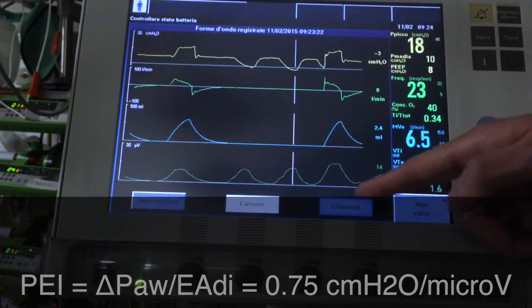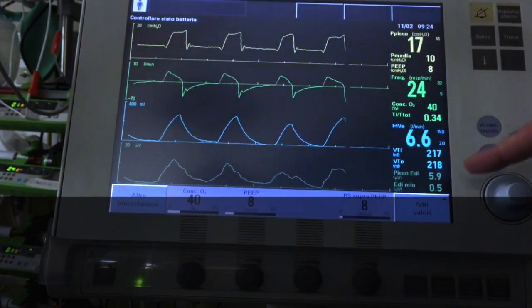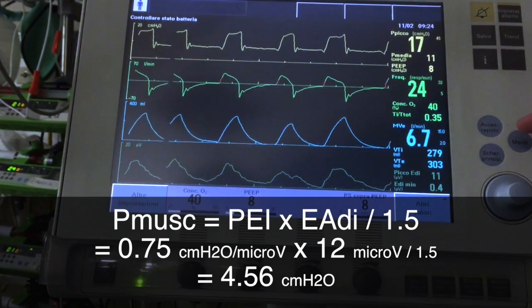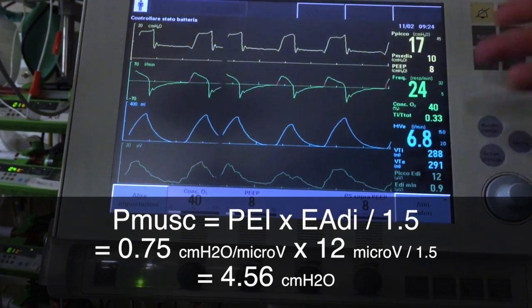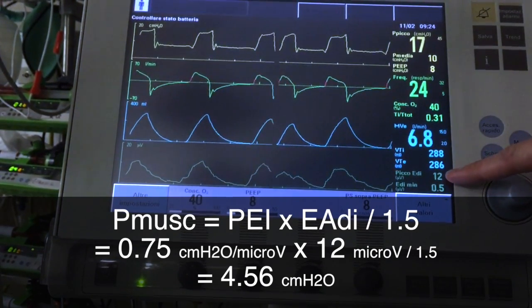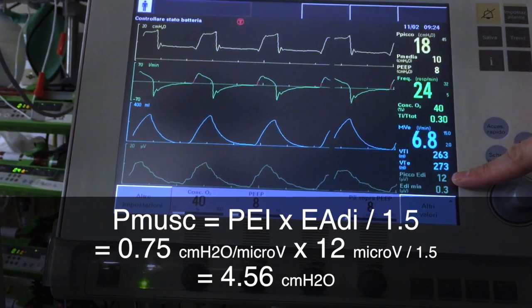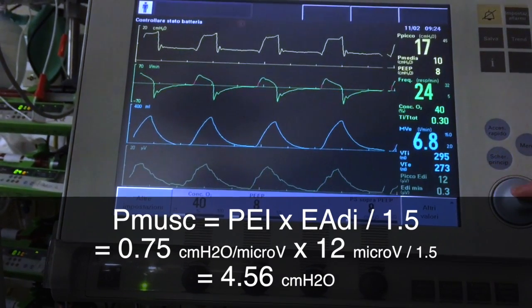In any moment during tidal ventilation, if we multiply PEI by the E-ADI and then divide it by 1.5, we obtain the pressure generated by the respiratory muscles. In this case, about 4.5 cm of water.